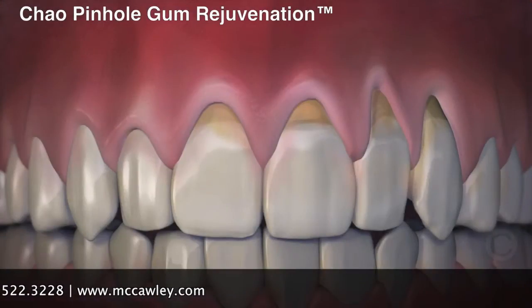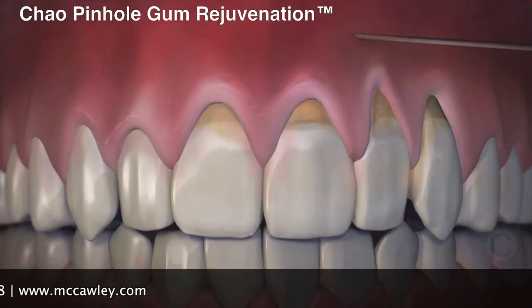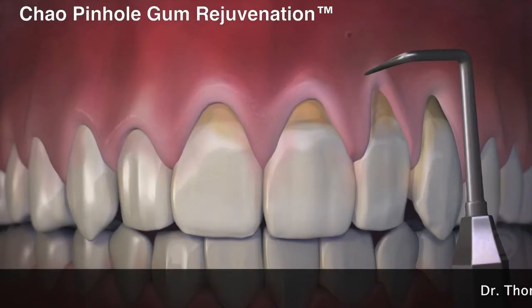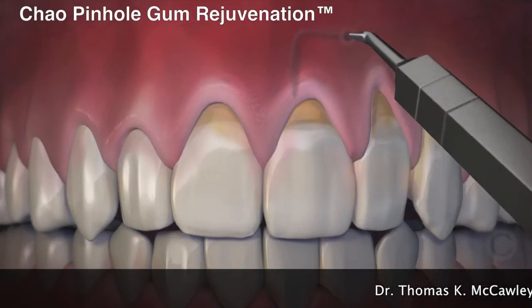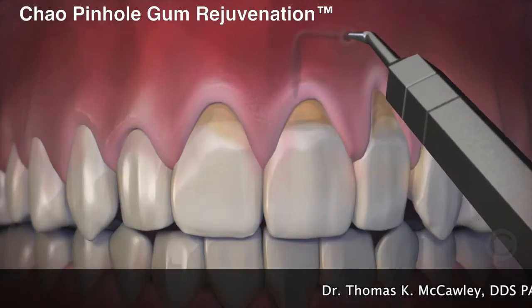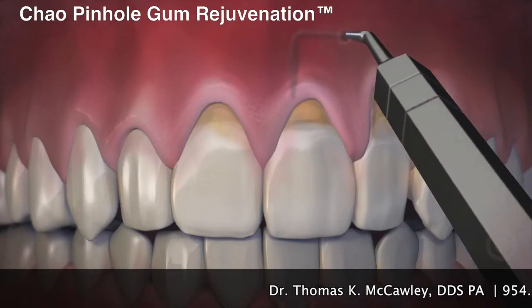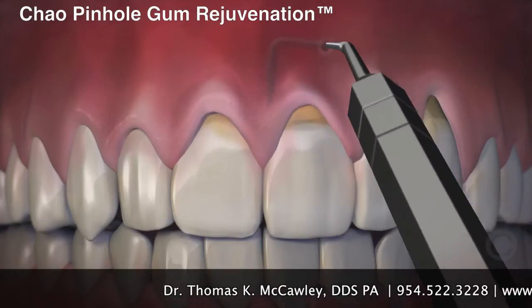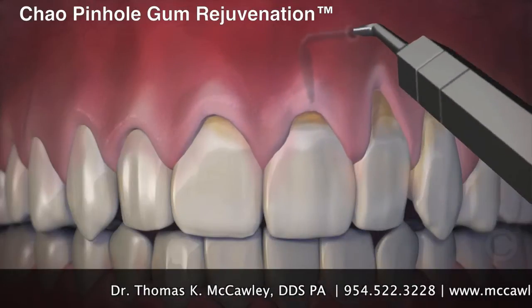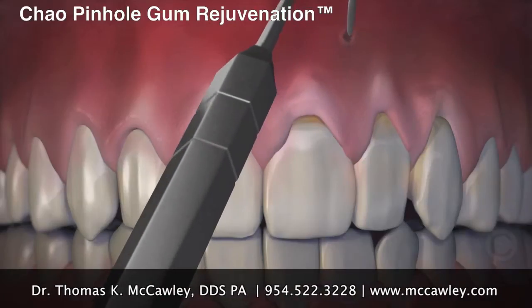Now, with the revolutionary Chao Pinhole Gum Rejuvenation, gum recession is corrected without cutting or stitches. This new process begins with a tiny entry point that is made in the gum. Then, a special dental instrument is placed through the pinhole to free the gums with gentle movements. Once free, the gums are guided down into a healthy position.